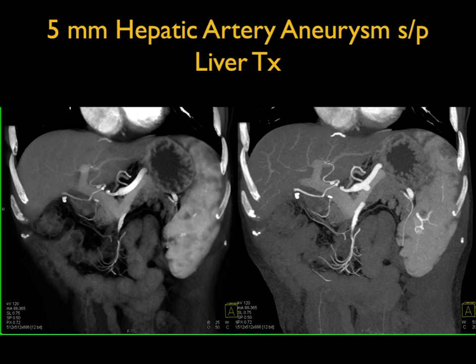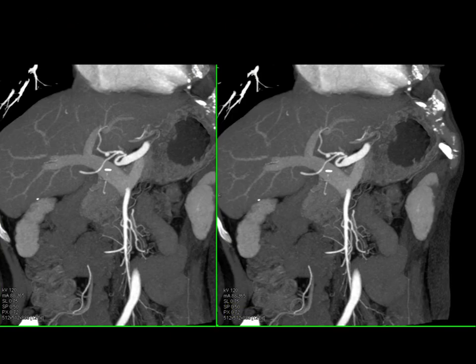Here's a good example of a patient who is post-liver transplant and you're looking for tumor, but what you find is this patient's five millimeter hepatic artery aneurysm, which can in time be problematic. Very easy to recognize, very easy to see.